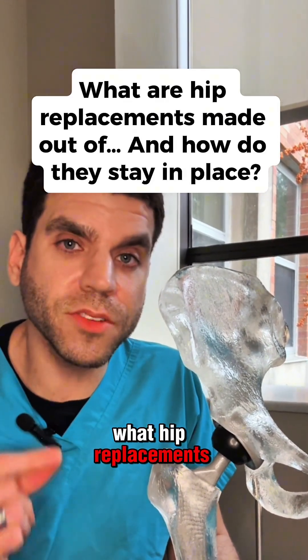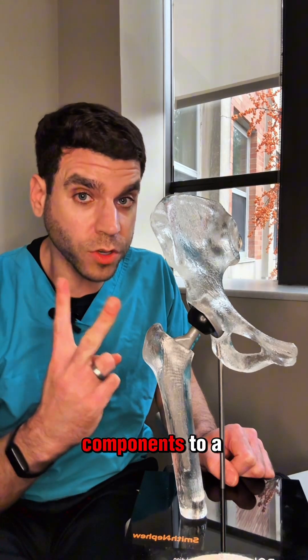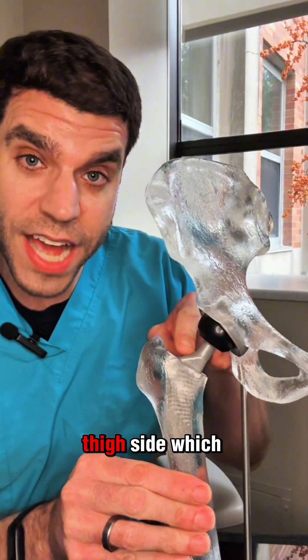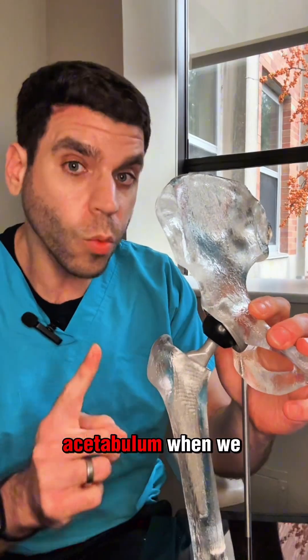People ask me all the time what hip replacements are made of and how they stay in place. So let me show you. There are two components to a hip replacement: you have the thigh side, which is the ball, the femur, and you have the socket, which is the acetabulum.